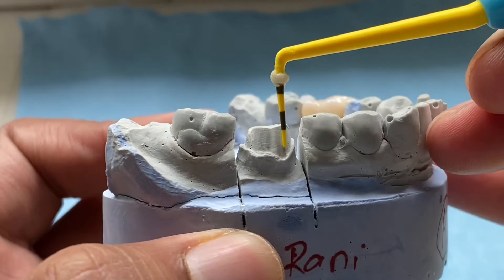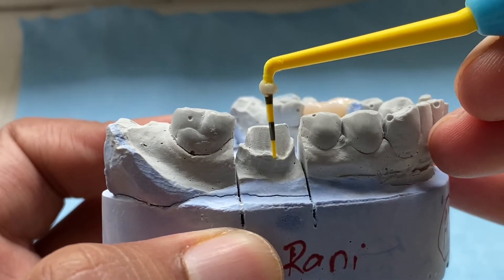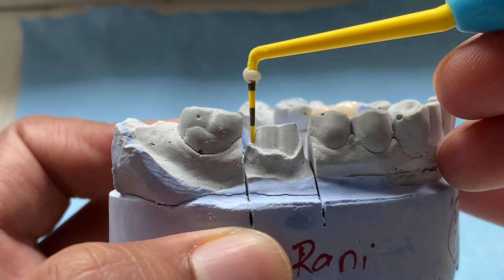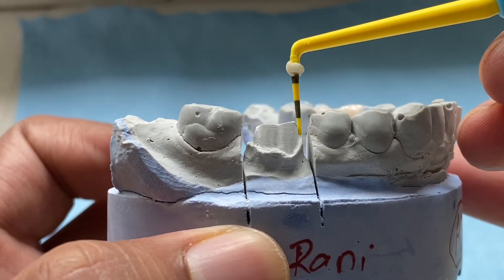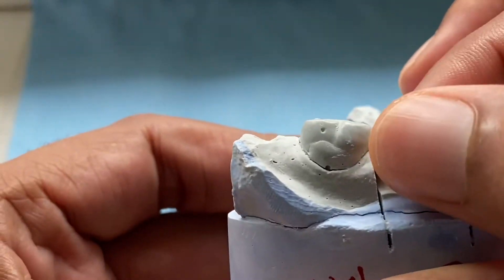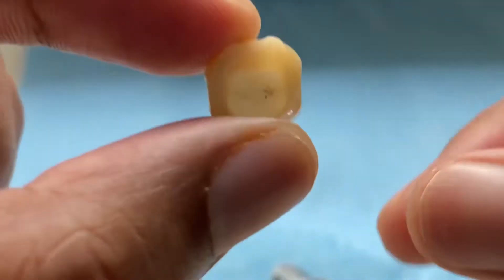In this video, we learn how to cement full contour zirconia crowns. Always consider cementation of zirconia crowns when you have 4 mm of axial walls and parallel axial walls. Check the margins and contact points of zirconia crowns.